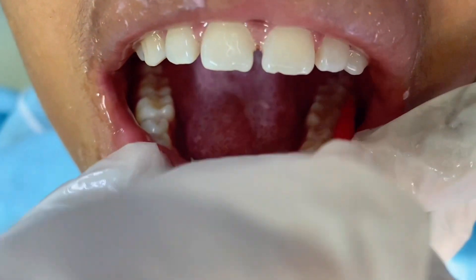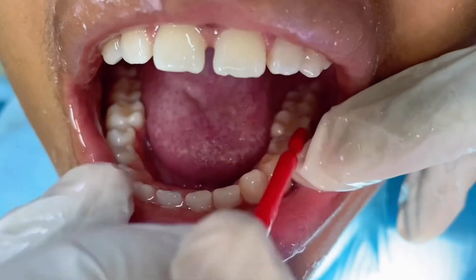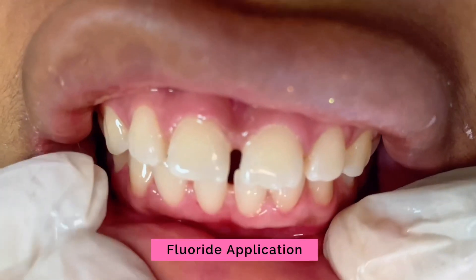Last is the application of fluoride on all the surfaces of the teeth. I have a video series on five parts about fluoride — you might want to watch that. It's quite interesting.